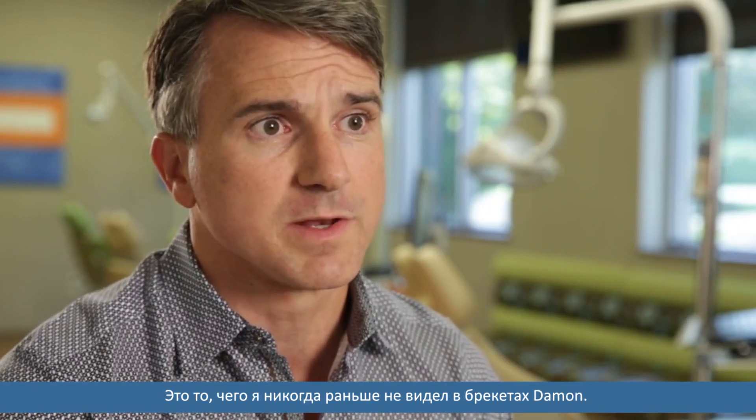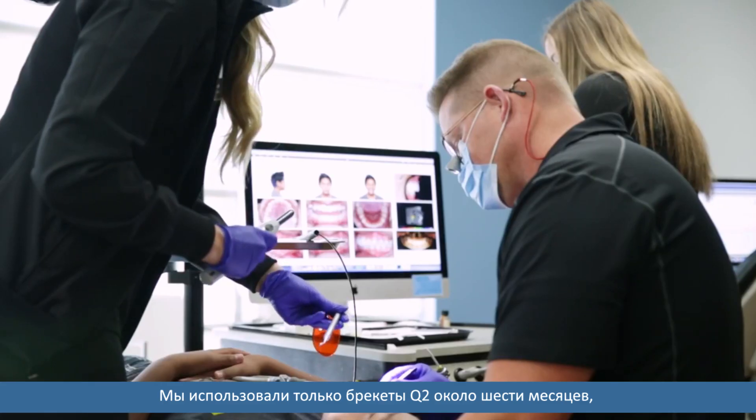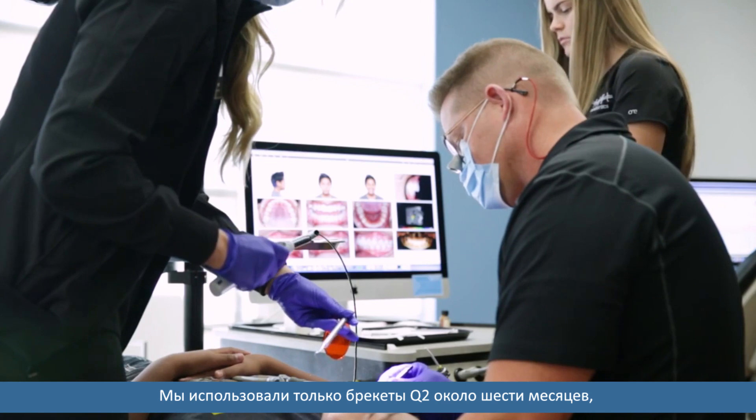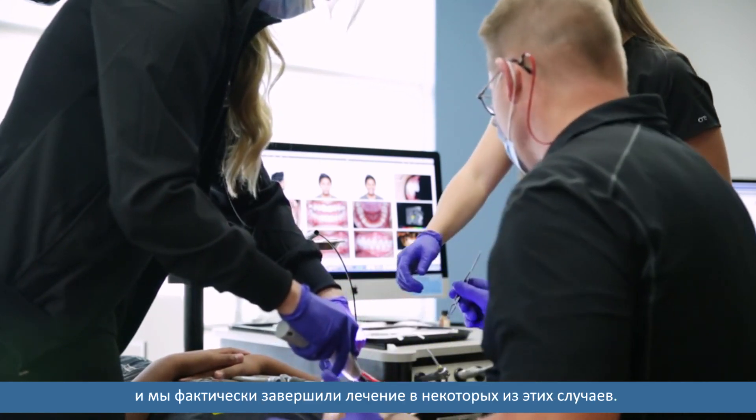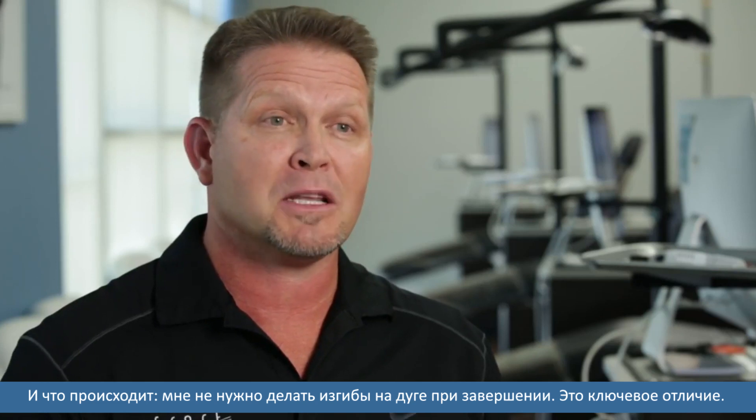It's just something I've never seen with the Damon bracket before. We've only been using the Q2 bracket for about six months and we've actually been finishing some of those cases. And what's happening is I don't have to bend as much wire at the finish — and that's key.